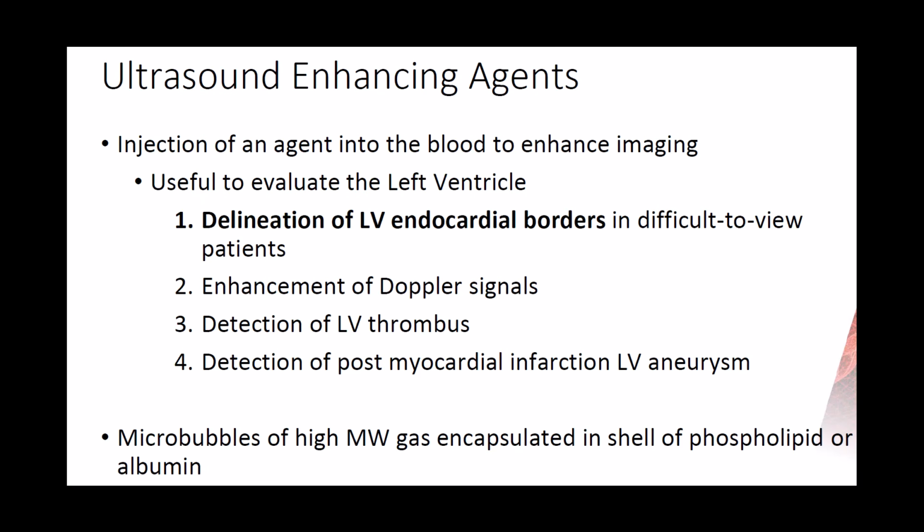So now talking about the ultrasound enhancing agents, which used to be called echo contrast. The question is, are these agents limited to the echo lab, or can we use them in ICU as well? The answer is that there is no patient population that benefits more than critically ill patients from the ultrasound enhancing agents, which is the echo contrast. This is not like a true contrast. It is microbubbles of high molecular weight gas, so it's gas encapsulated in a shell of phospholipid or albumin.